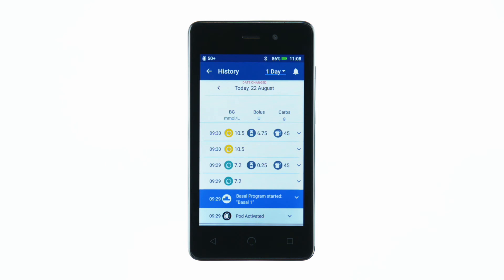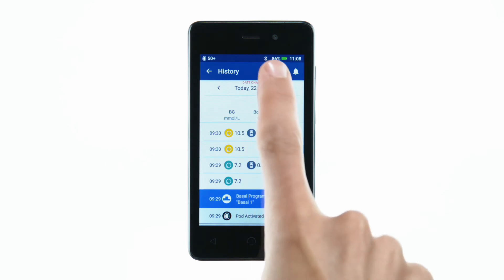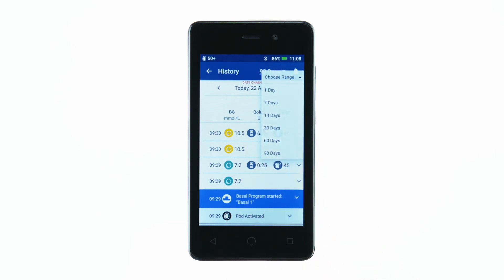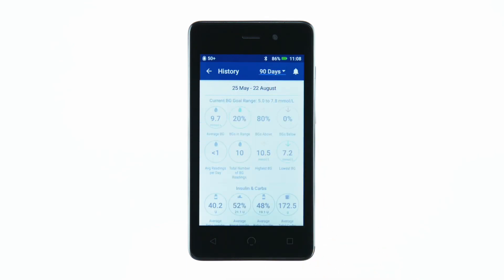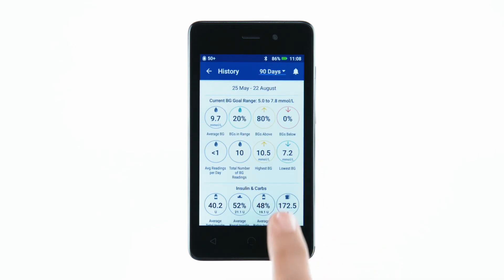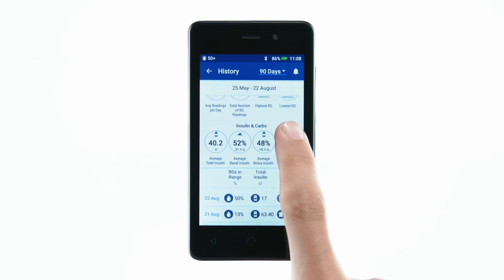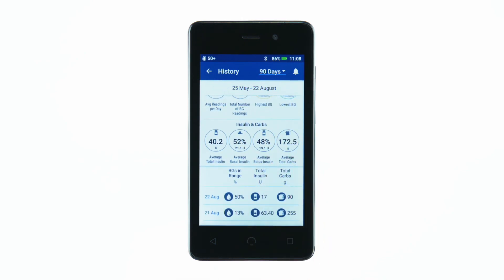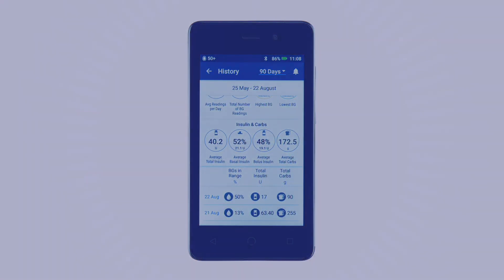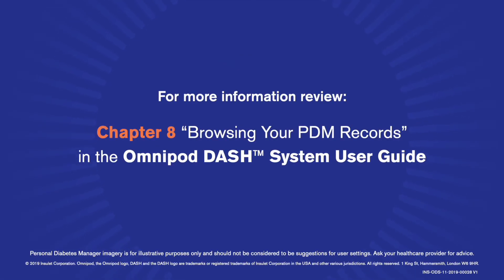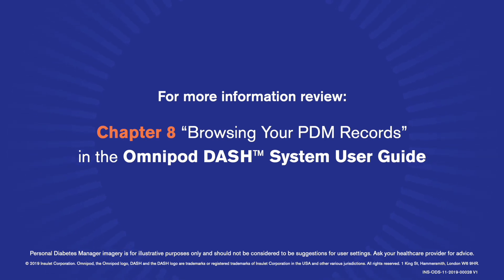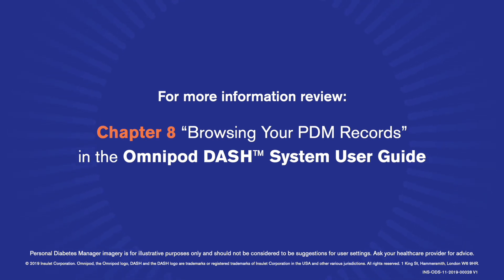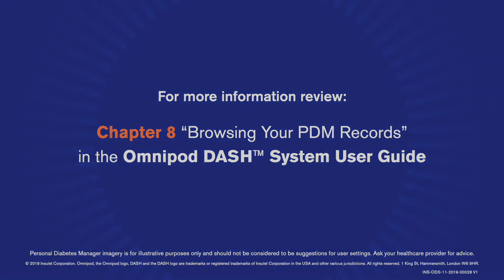To change the time span of the data you're looking at, tap the drop-down menu in the upper right-hand corner. To see more details from the current history screen, swipe up.